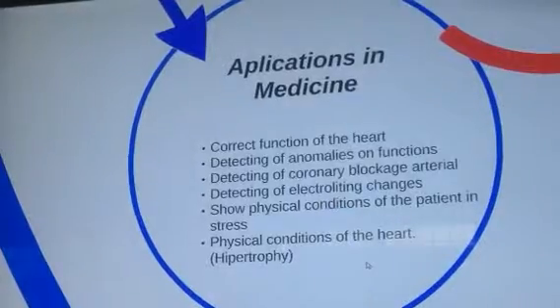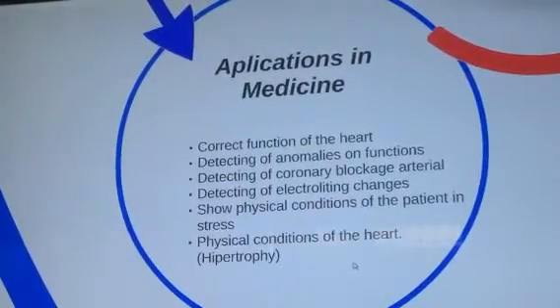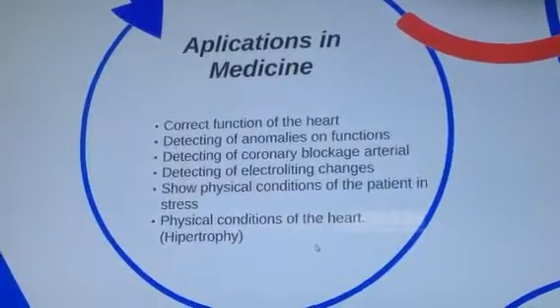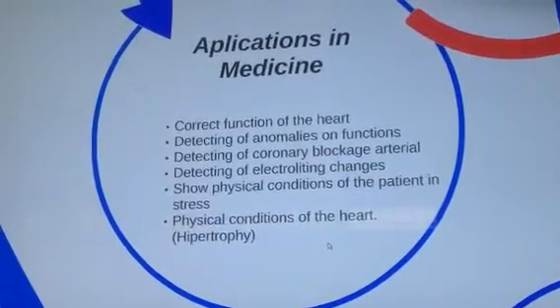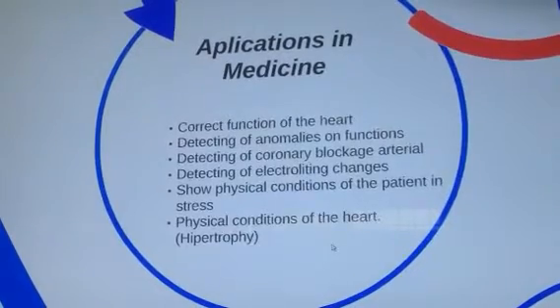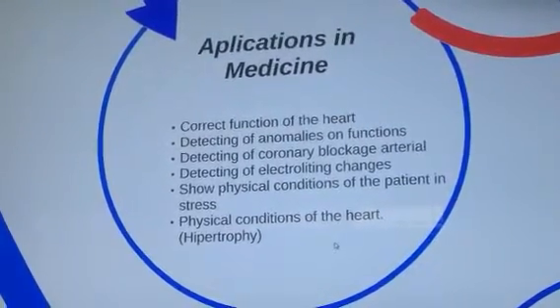Now, continuing with the presentation, I'm going to talk about the applications in medicine. First of all, we have the correct function of the heart. Second, detecting anomalies of function, detecting coronary arterial blockage, detecting electrolytic changes, showing the physical condition of the patient under stress, and the physical condition of the heart, like hypertrophy.